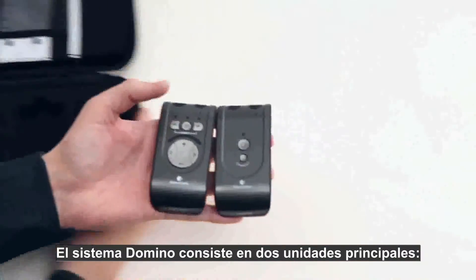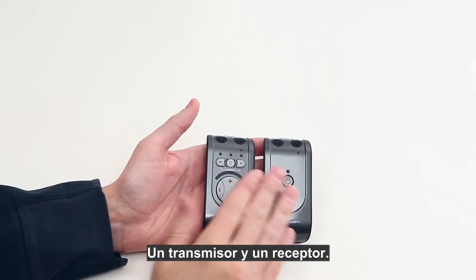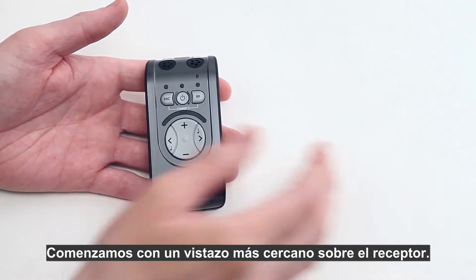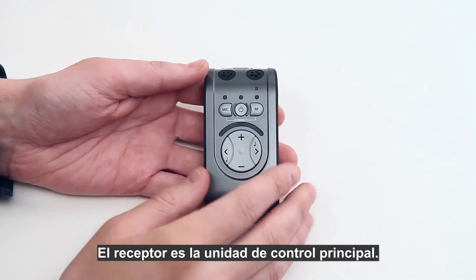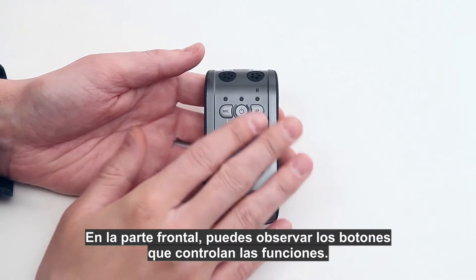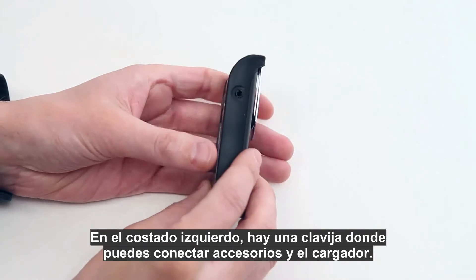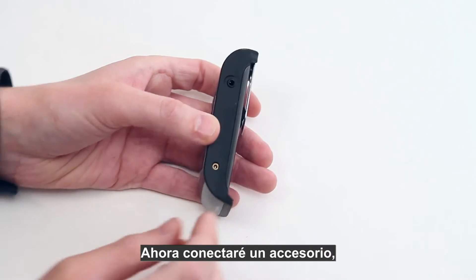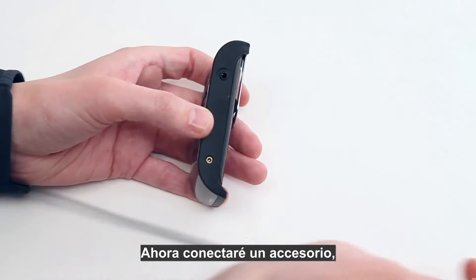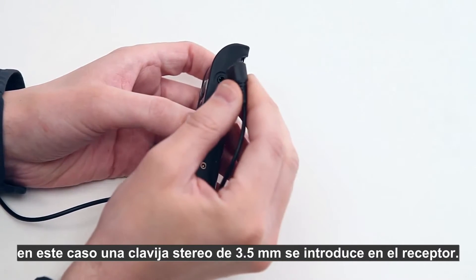The Domino system consists of two main units: a transmitter and a receiver. Let's start with a closer look at the receiver. The receiver unit is the main control — on the front you see the buttons that control all functions, and on the side you plug in the listening accessories and the charger. I will now connect the listening accessory, in this case a 3.5 millimeter stereo plug.